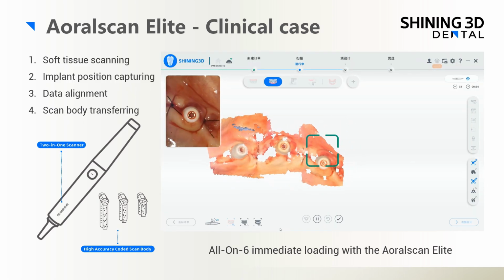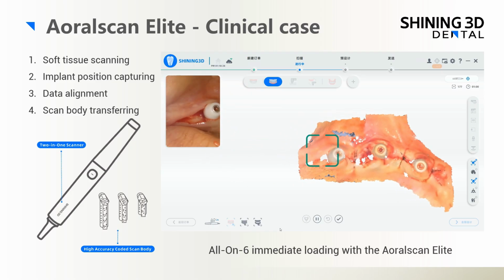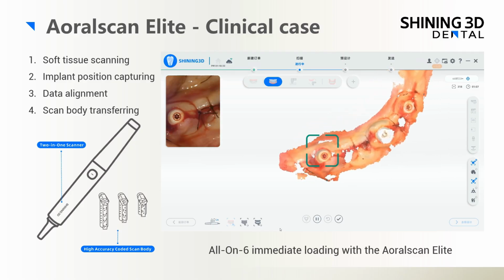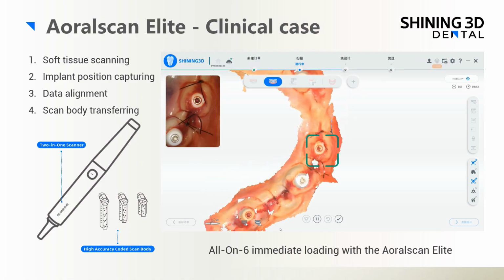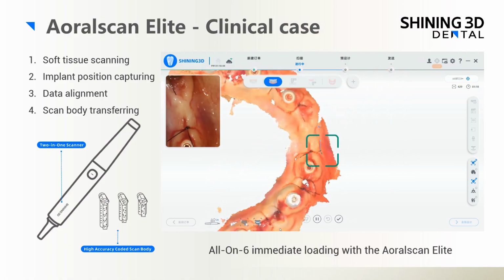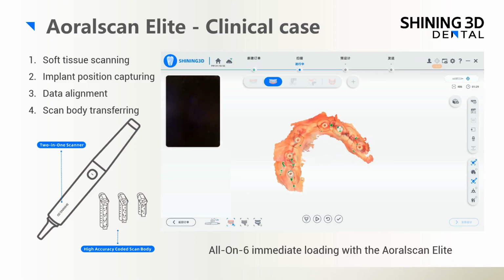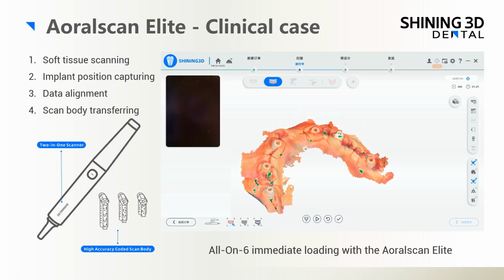Aoralscan Elite is a 2-in-1 system combining an intraoral photogrammetry system and an intraoral scanning system that allows for soft tissue scanning using the intraoral scanning and capturing implant positions utilizing the intraoral photogrammetry technology. Then, the soft tissue data and implant positions are aligned within a single scanning workflow, collecting all the necessary data for full arch fixed restoration designs using one single device. If blood control is good post-surgery, Aoralscan Elite can complete the soft tissue scan within 1 minute.